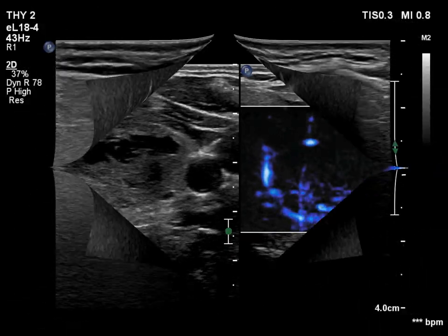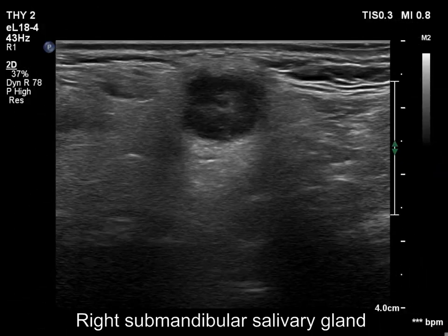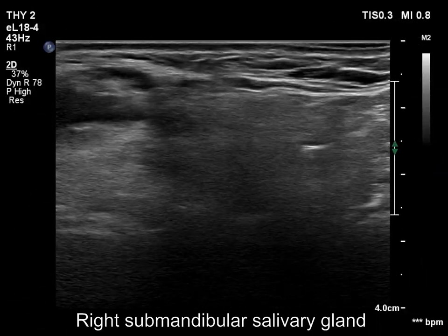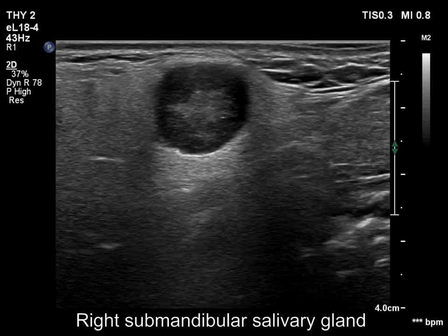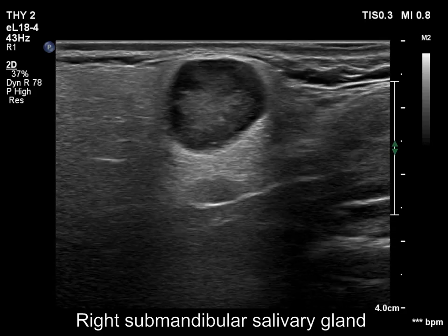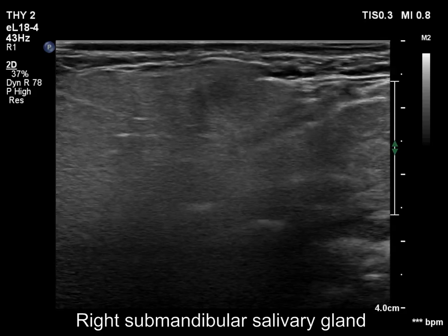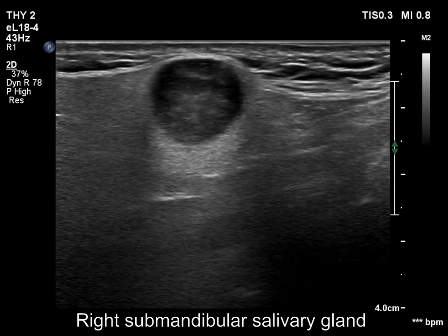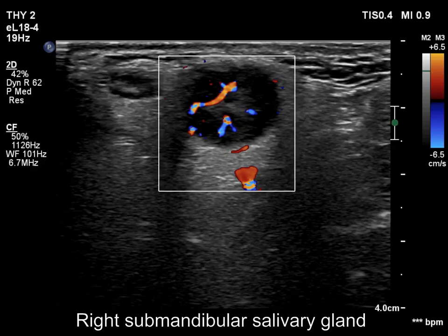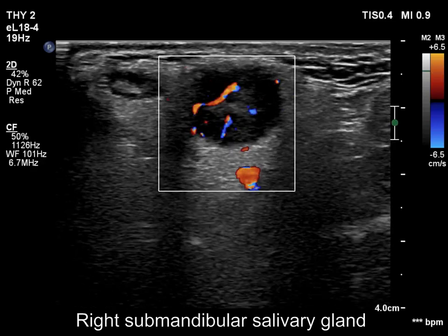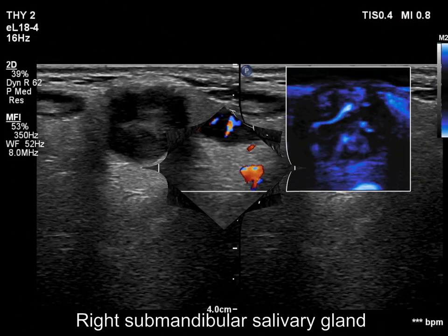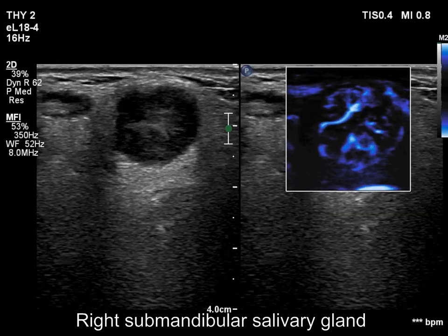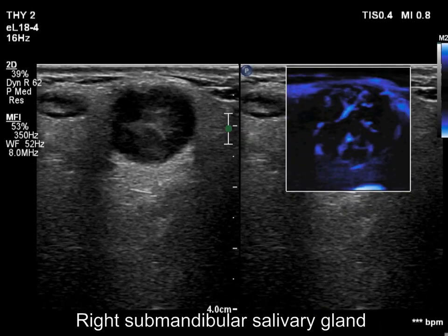Now, the right submandibular salivary gland is shown. Here we can see a mass which is composed of a central minimally hypoechoic mass surrounded by very hypoechoic areas. Note the acoustic amplification dorsal to the mass. The lesion has vascularity even in the very hypoechoic parts, as indicated by the yellow arrows, meaning these parts are also solid.